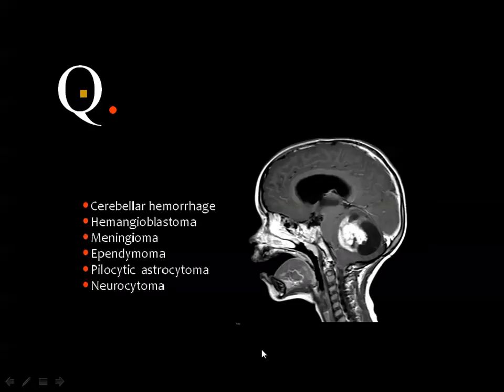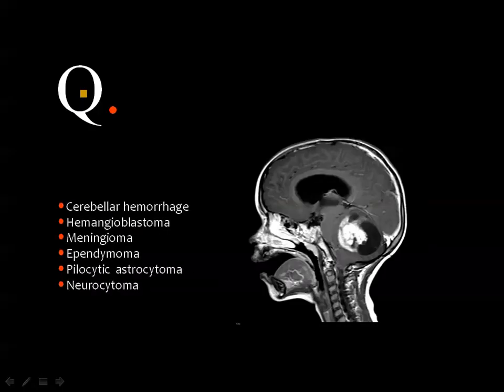نبتدي. يعني أتوسل إليك أبوس إيدك تقول إيه هو نوع الفحص. أوكي، أو أنا ممكن أريحك وأقول إيه هو نوع الفحص وبعدين أنت تجاوب.